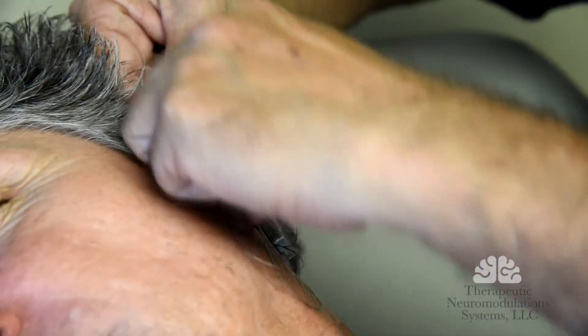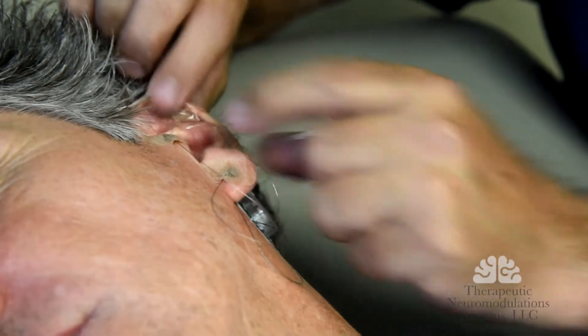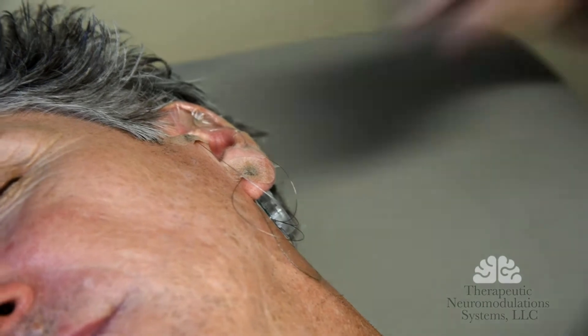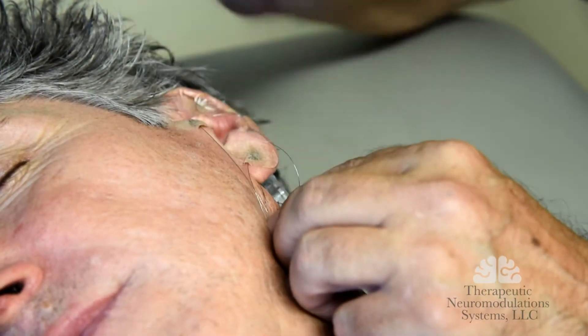So I just taped that wire up like that, put it in place. You get it like this — it's not really neat. And then I'm going to tape these three right now. I'm going to take these three wires and tape them down right here on top of that.